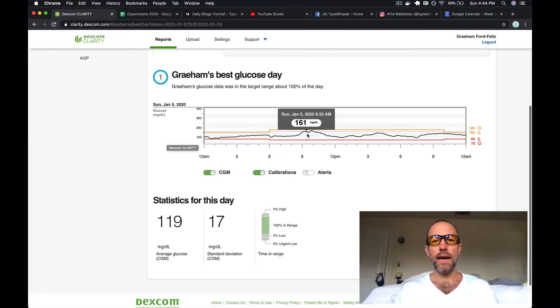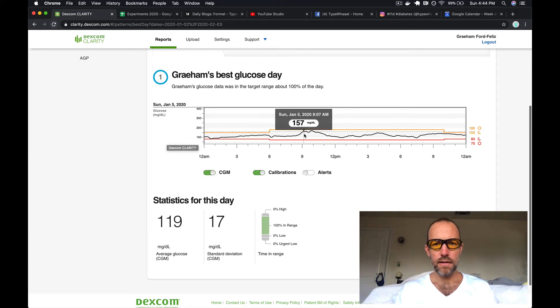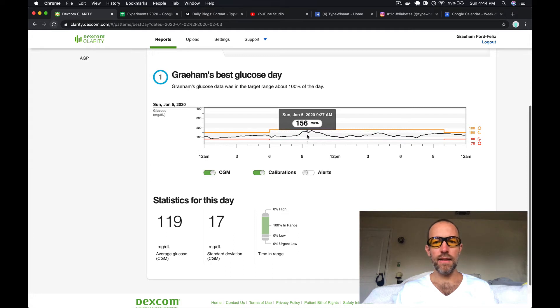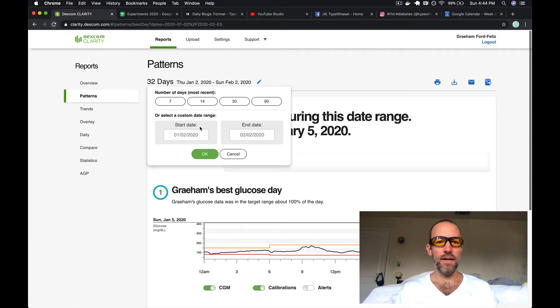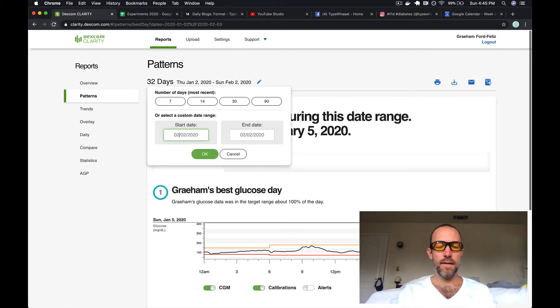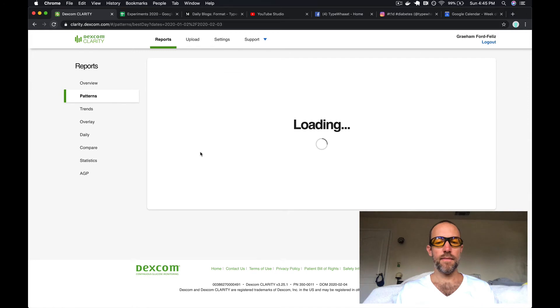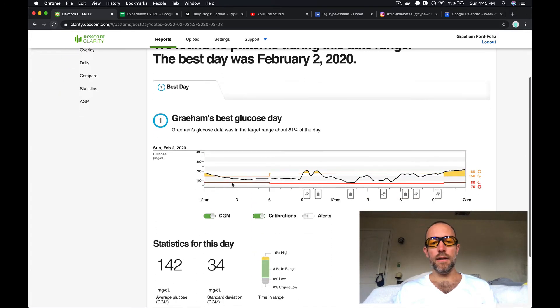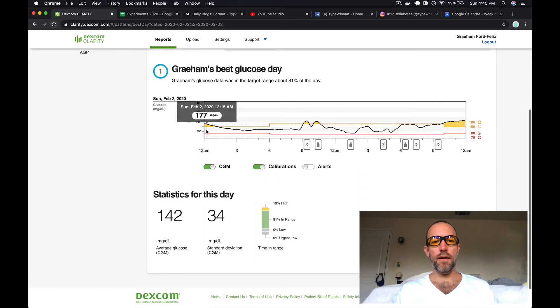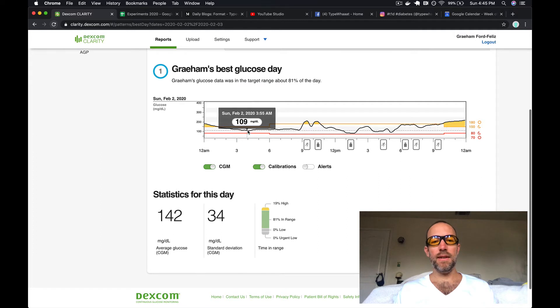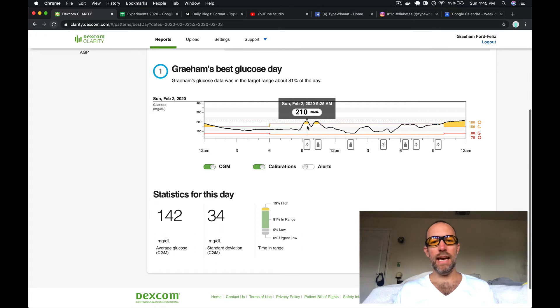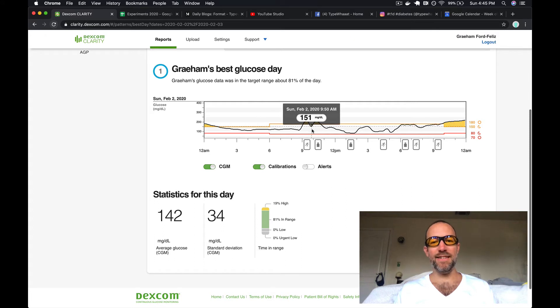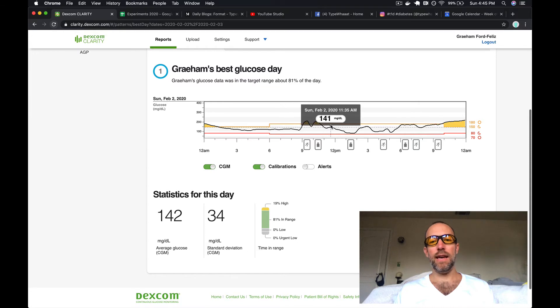If we jump over to our Dexcom Clarity, you can see that I did pretty good. I got a little bit high here. Hold on, I have the wrong month here, that's why. Okay, so this day started with midnight I was kind of high but I was able to get down. Then pancakes brought me up, and then you get a little camelback where I ran so I dropped down to 151. Then I had my oatmeal and went right back up there.